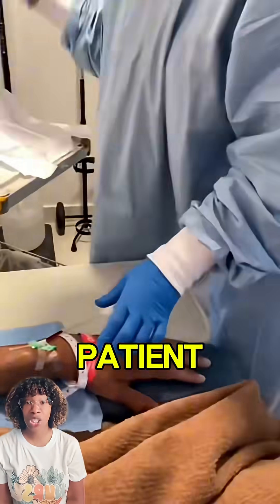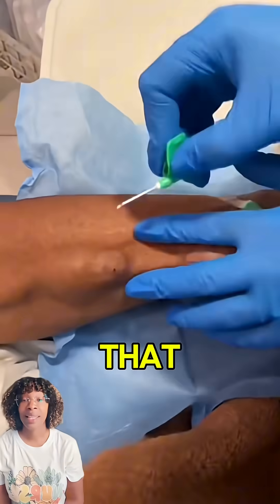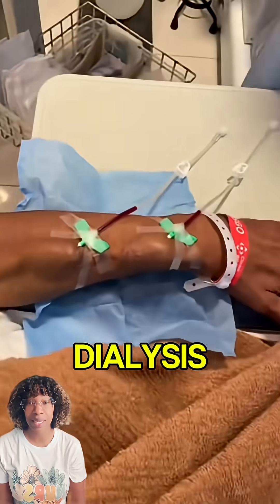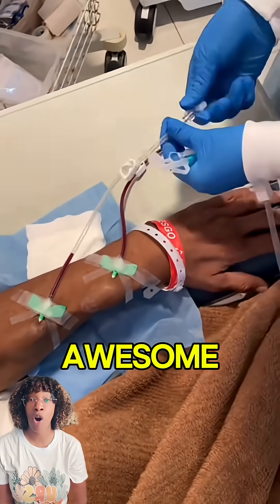But this patient has pseudoaneurysms — those humps right there — that need to be reduced because you don't want them to burst, because that could be a huge complication for dialysis. The young lady that has inserted the needles has done an awesome job.